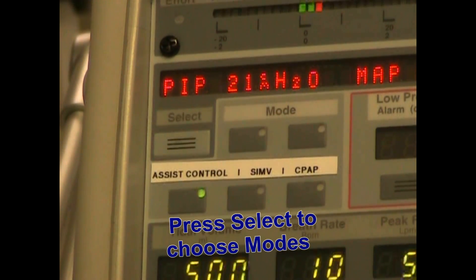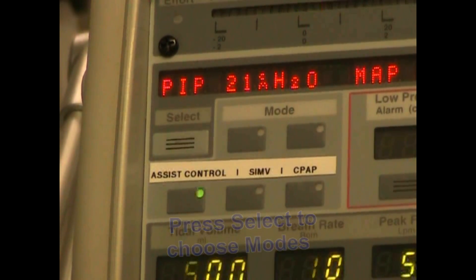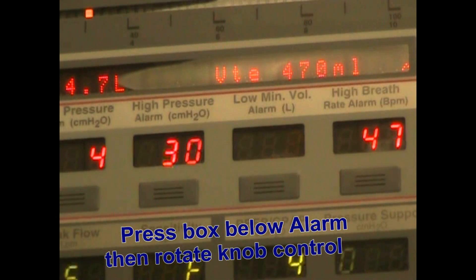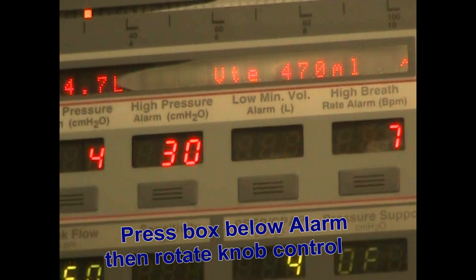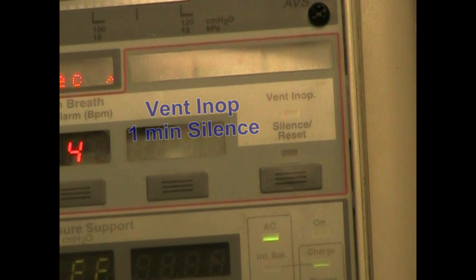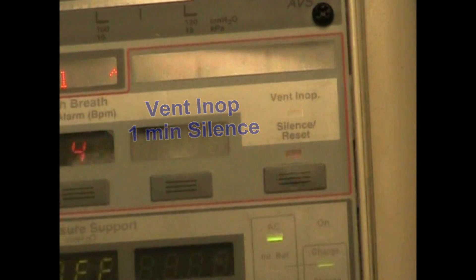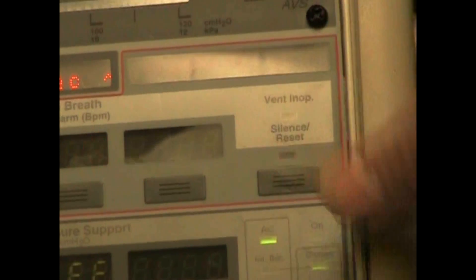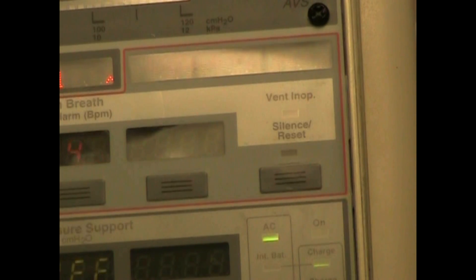Here you can see the mode settings, and then you see low pressure alarm, high pressure alarm, low minute volume, high breath rate, and the blank one. You see the vent in-op which is not lit, and silence and reset. If we hit silence, you have two to three minutes of silence, and you can reset that and take it off at any time.